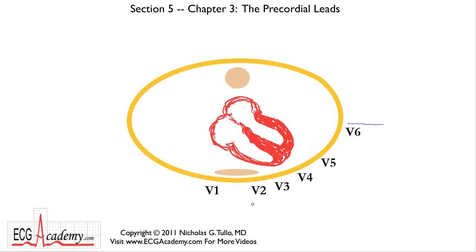And what do they record? Well, these are kind of like unipolar leads. Remember, unipolar leads are a single lead, and you're looking at voltage movement towards or away from that lead. Now, when the heart depolarizes, it's the electrical system that allows for proper synchronization and efficient depolarization. And I've drawn in the cardiac conduction system here with the AV node in the septum. You've got the main bundle of His, a very thin right bundle coming to the right ventricle, and then a large left bundle that splits into hemifascicles and other branches.